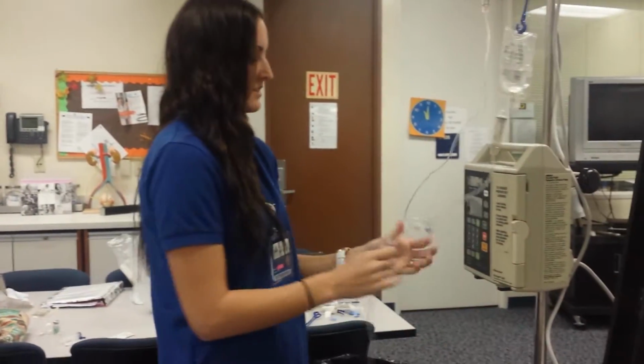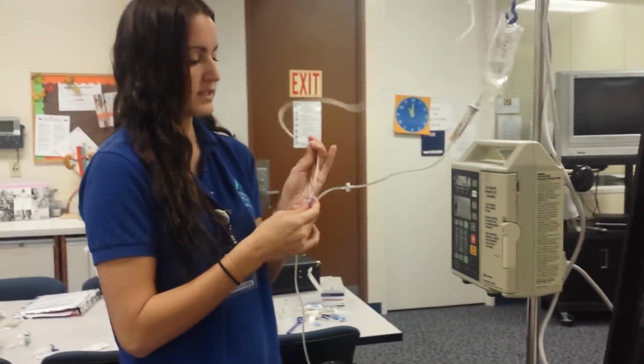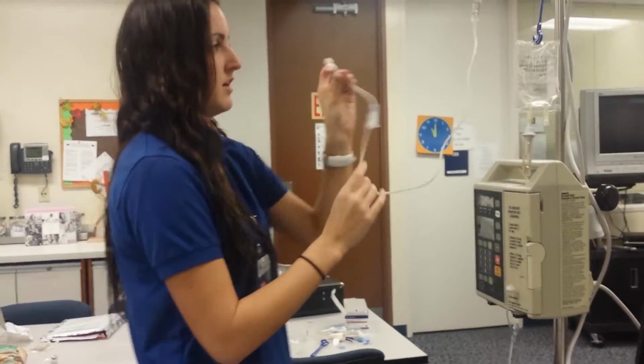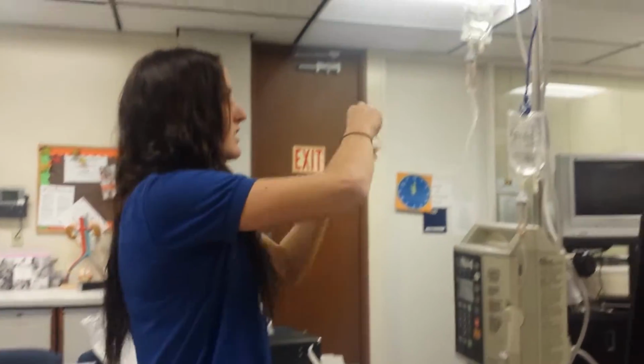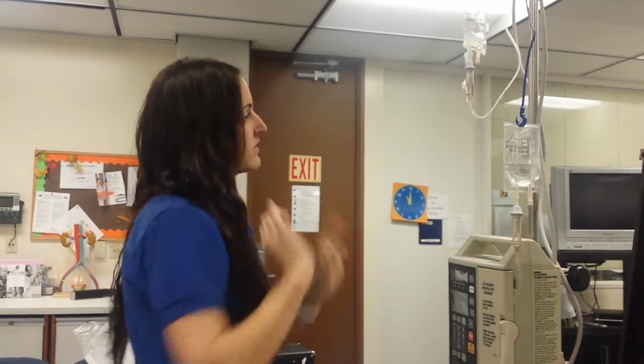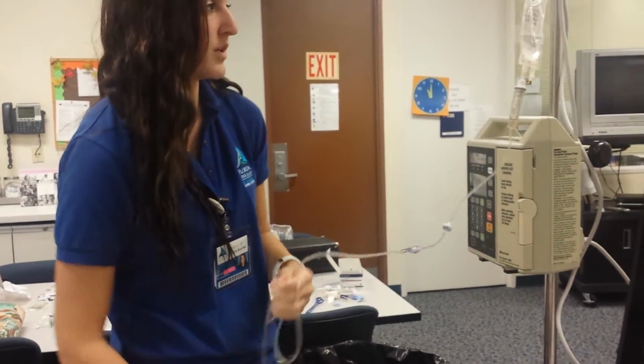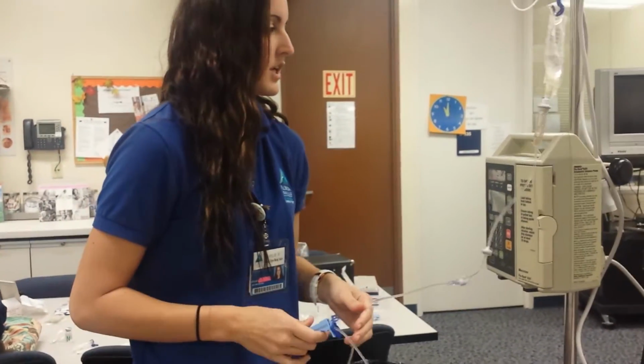And going to go ahead and disconnect it. It's all done, so I'm going to clamp this roller clamp and disconnect the secondary tubing. Put a cap on it in case they need to give another round of Vanco within 24 hours. And then I'm going to reopen the primary, check the site, reopen it to establish what it was doing previously, which is 100 an hour.